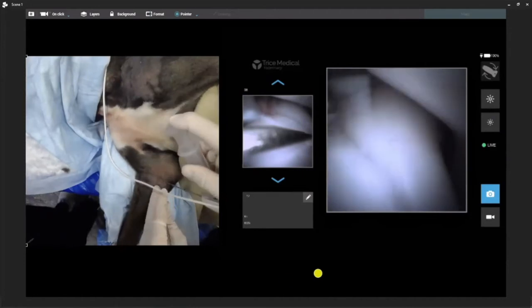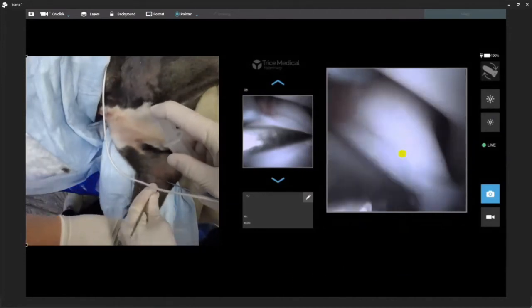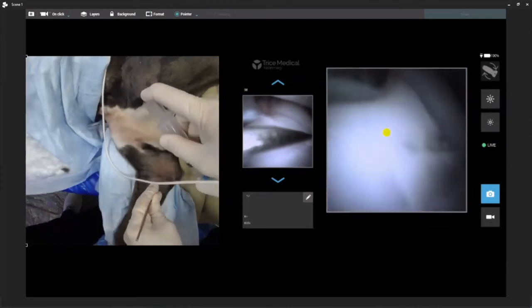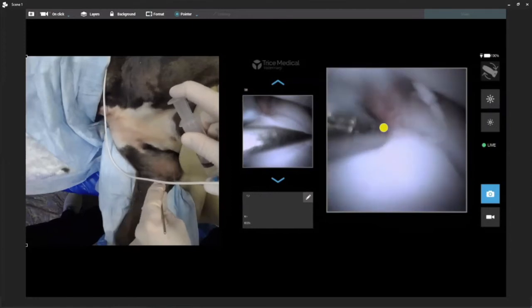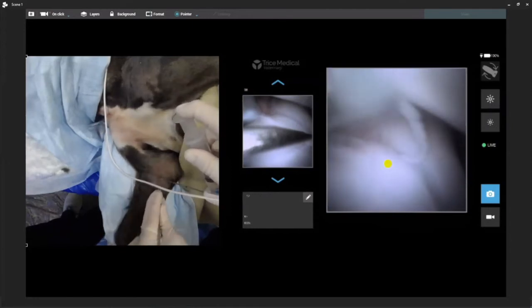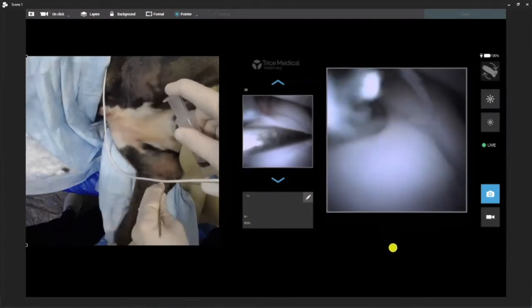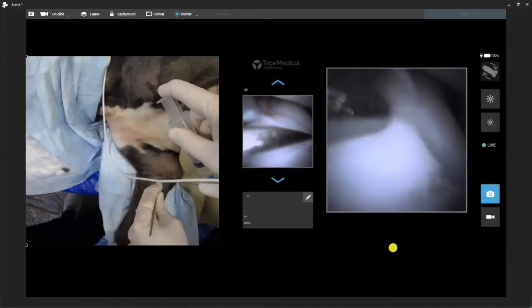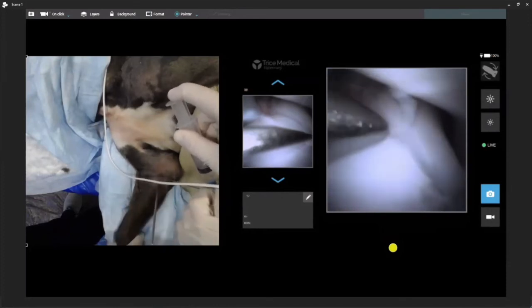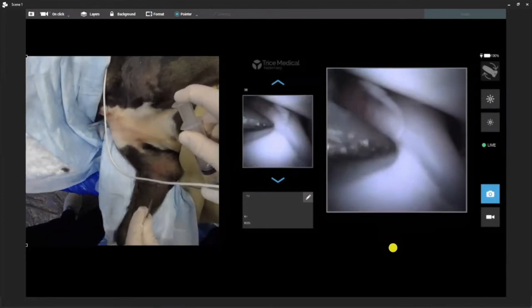Here we are. You can see very, very nicely — humeral condyle, there's our radial head, and here's the region of our coronoid. So if we want to do a subtotal coronoidectomy, I think we can very easily do that. We want to get in here and remove our flap and shave our OCD — we can easily do that. The broad areas within the elbow compartment, I think we can address those as well. So everyone can see pretty decent image quality.